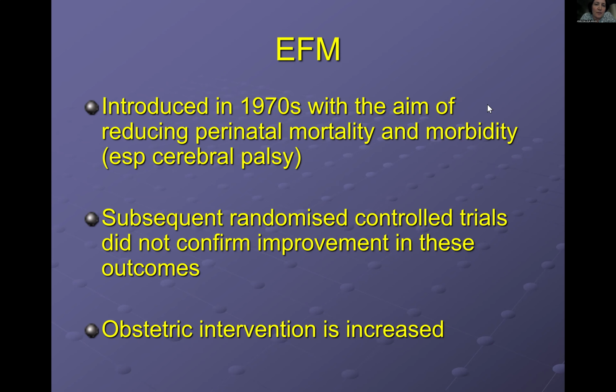The truth is that it was taken as so obvious that once you have EFM, it's obviously going to do good and no harm at all. However, with time, many randomized control trials were carried out, and sadly they didn't confirm improvement in all of these outcomes.